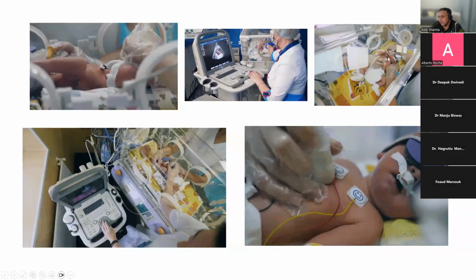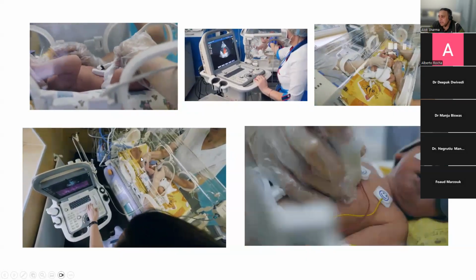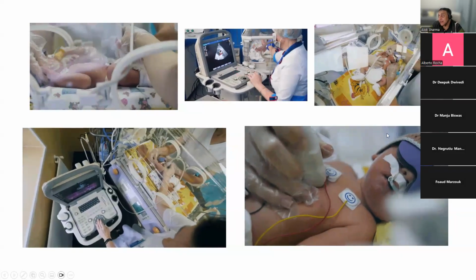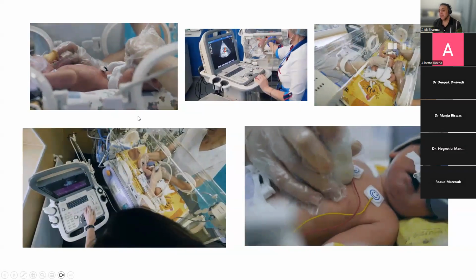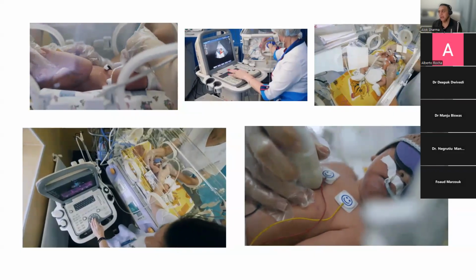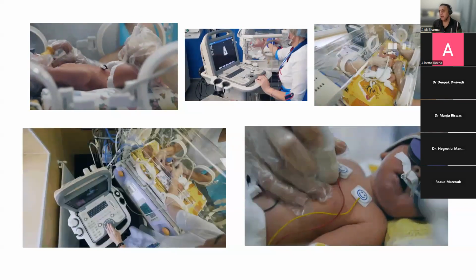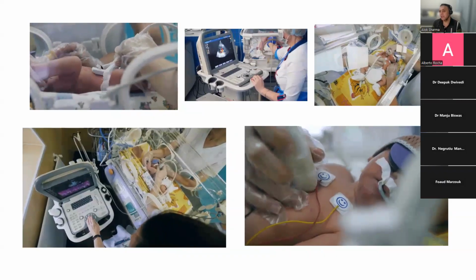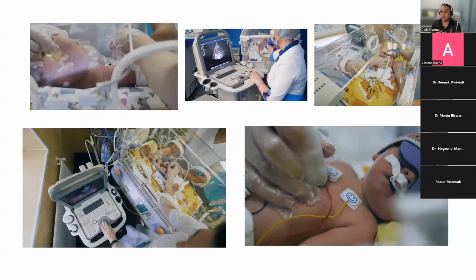What is really important is that you need to practice containment properly. Here, no movements, the baby's comfortable, he's got a dummy in his mouth, he's had some sucrose. And this is naturally a very sick baby that you can see over here on sedation. I have never needed to use sedation for a cranial ultrasound. My recommendation is that you can do a lot of containment in a non-painful, comfortable way to get your images. Using sedation in sick babies for cranial and lung ultrasounds, in my opinion, is not recommended.